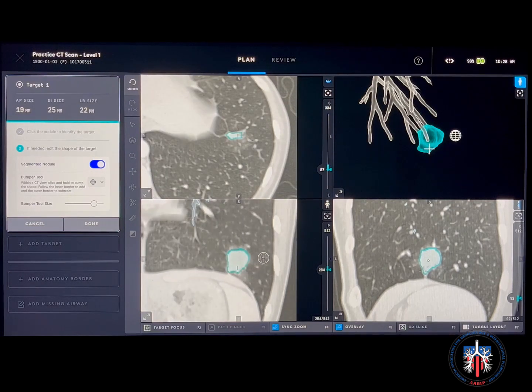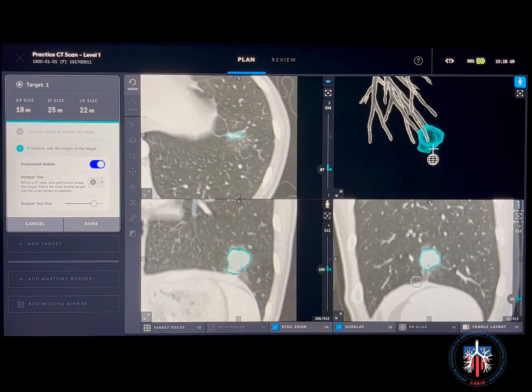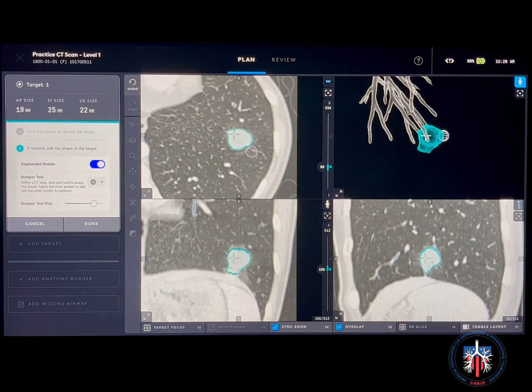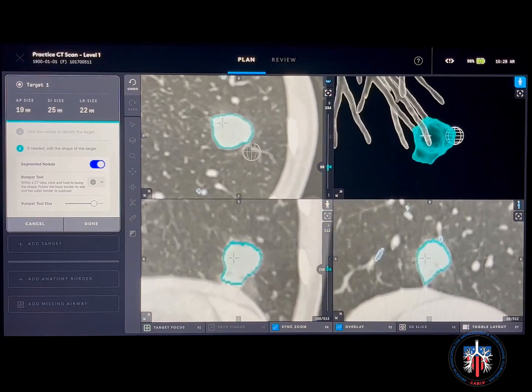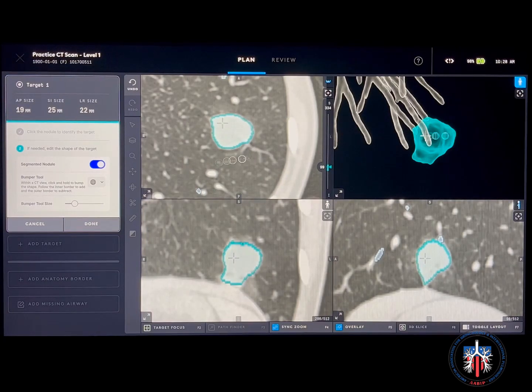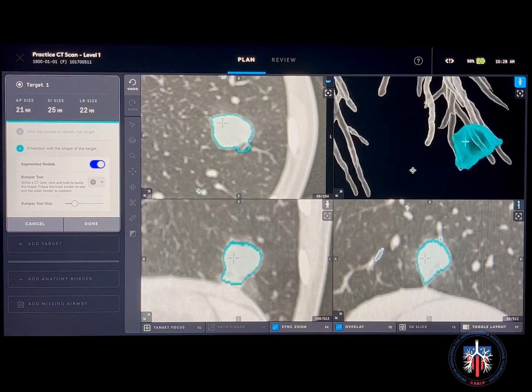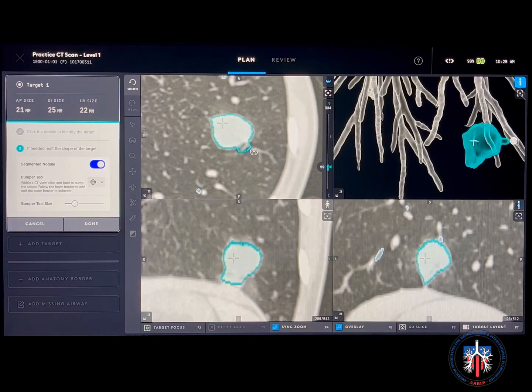Examine the contours of the nodule in all three views. You can then adjust the contours as needed using the bumper tool. Set the bumper tool to the desired size. To increase the segmented target, click inside the nodule and drag outwards. To decrease the nodule size, click outside the nodule and drag inwards.